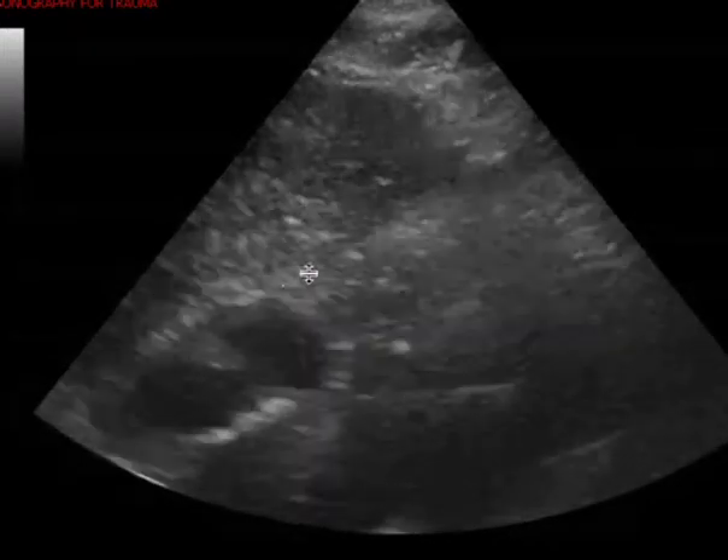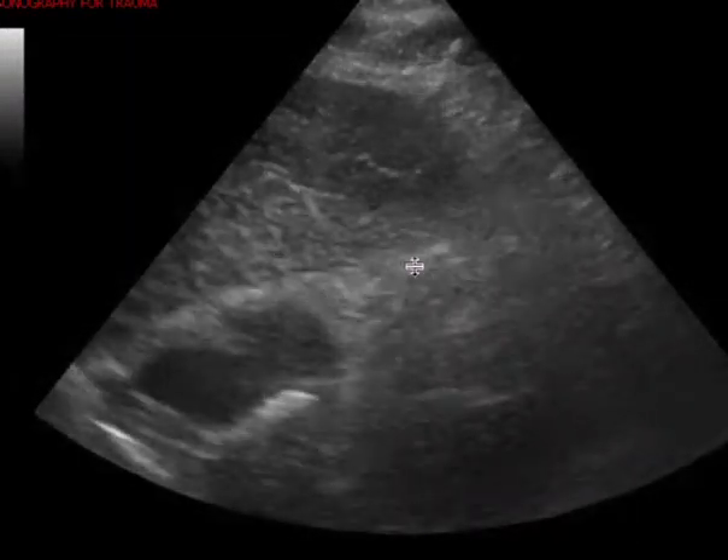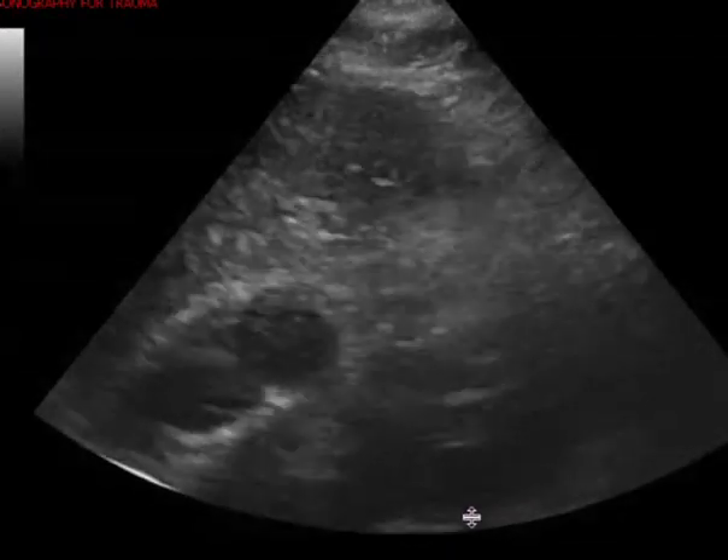There's your liver, and here's your anterior pericardium. What I also need to see is the posterior pericardium, so I would have increased your depth a little bit.